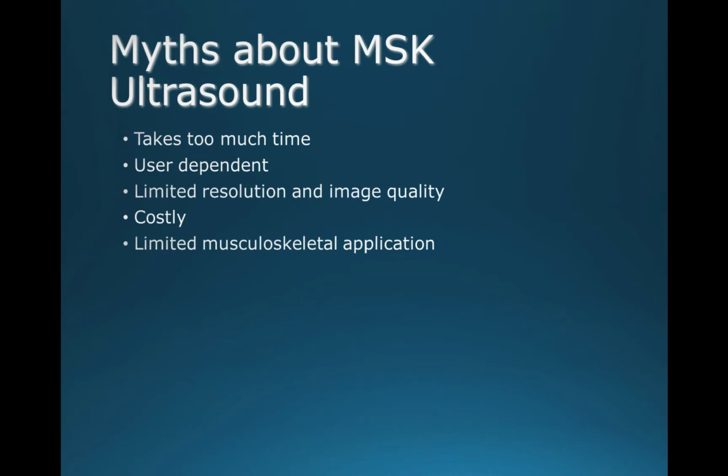So I'm going to take some time right now to go over a few of the myths about musculoskeletal ultrasound. Some people think it takes too much time, it's user dependent, it may have limited resolution and image quality, could be costly, and has limited musculoskeletal application.